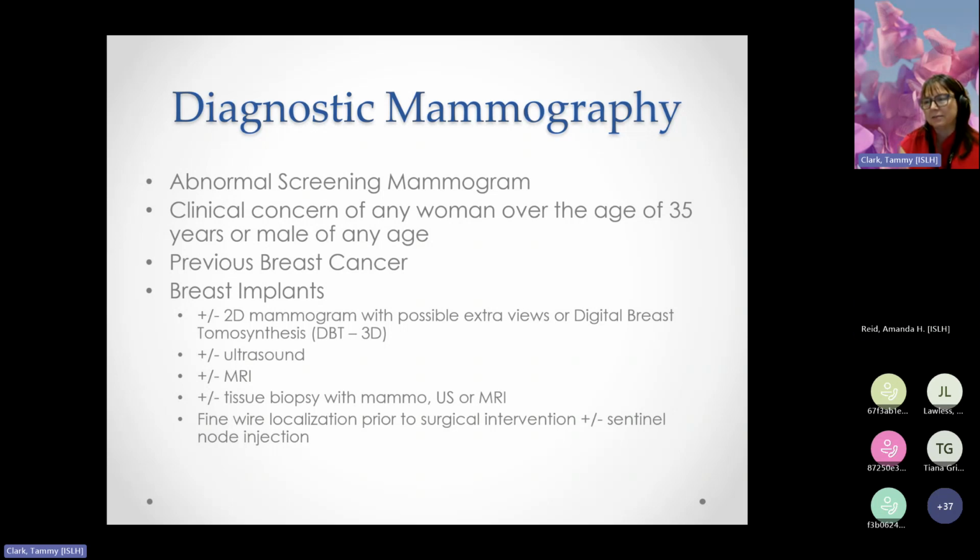So when someone gets an abnormal screening mammogram, they note on the requisition, is it A, low suspicion? Is it B, moderate, or C, high suspicion? So most people that get a call back have a low suspicion. And what we can tell those people when we get them to come back is, 90% of these abnormalities turn out to be overlapping tissue or something benign. Try not to worry too much.